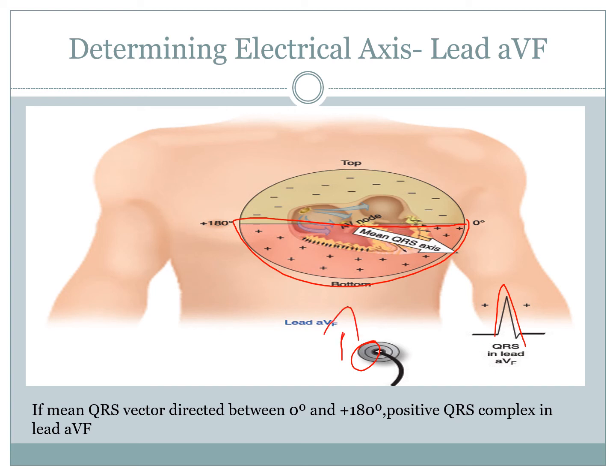So from the perspective of the foot, which is the positive end, the direction of normal travel is traveling towards the feet. On an angle, it's still traveling down the heart. So therefore, we should have a positive inflection. If it's traveling away from the perspective of the feet, it is going to be a negative inflection. So that's what both of those particular leads mean.